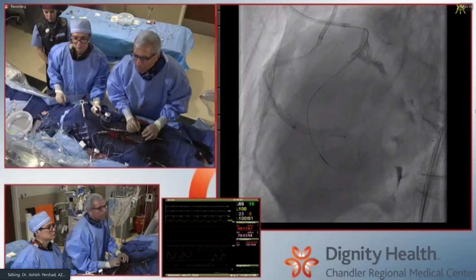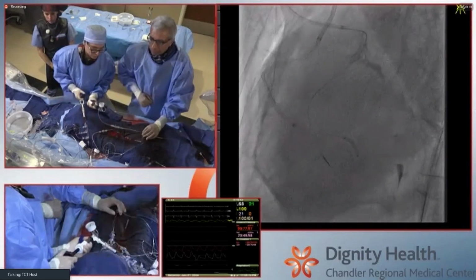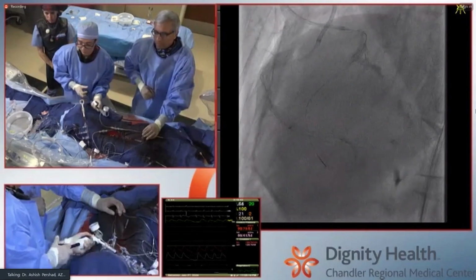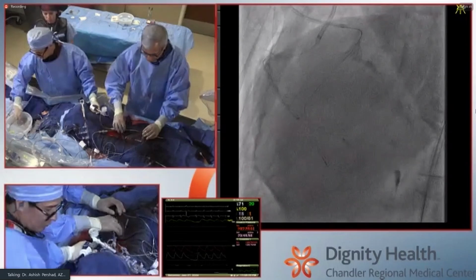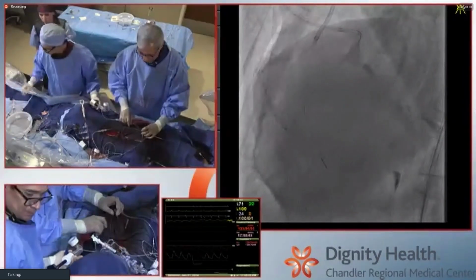Yeah, that's right. Gives you a nice measurement tool as well for how far you're going to have to go. Just gentle pressures down there. And yep. All right, I'll take a stent next.